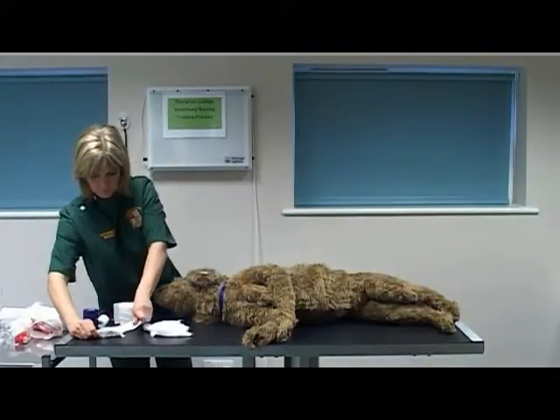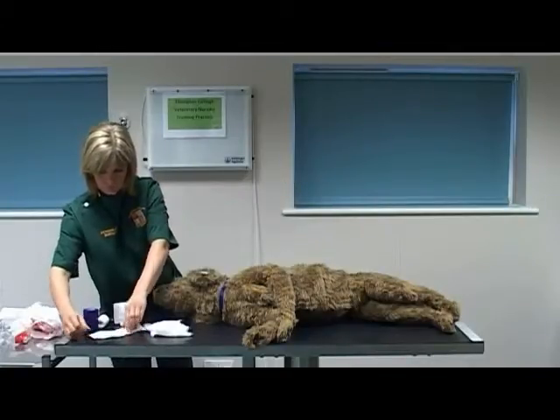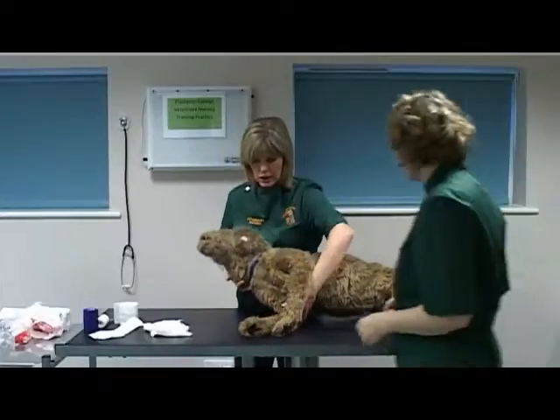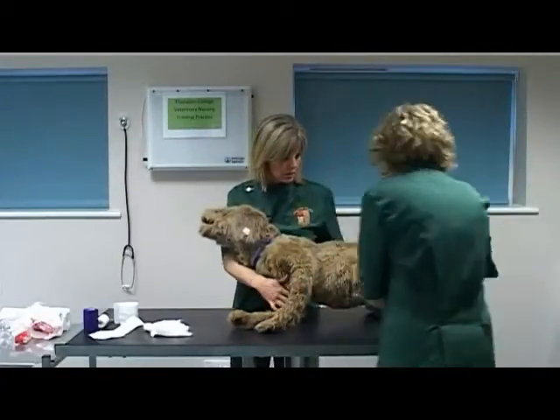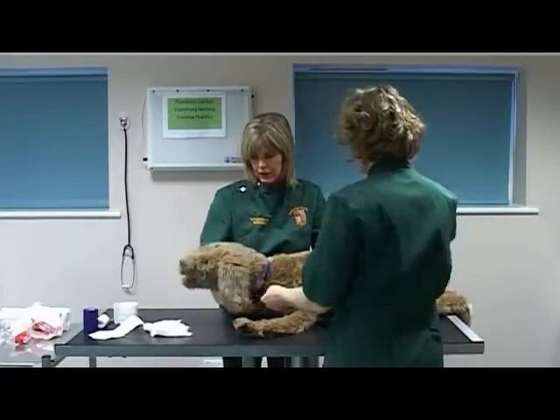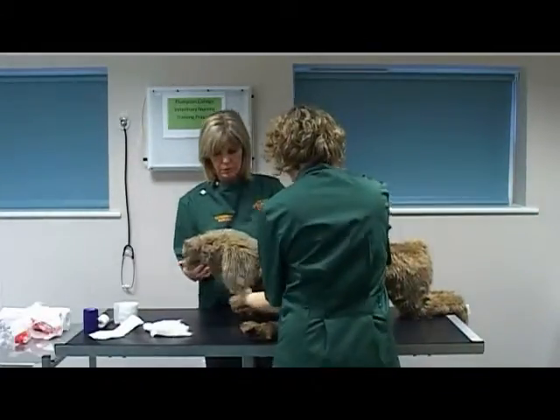Ask your assistant to hold the patient's head up to facilitate bandaging. I'm going to ask you to help me restrain my patient. I'm going to turn him onto his sternum. I'm going to ask you to keep his head upright for me please.